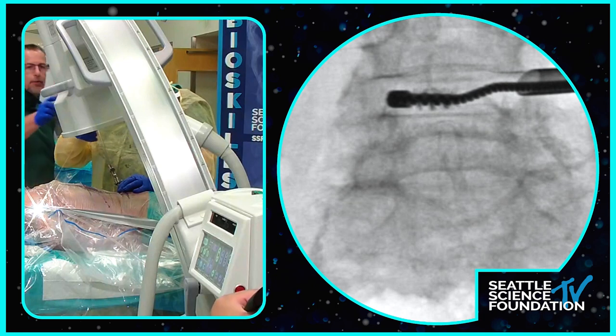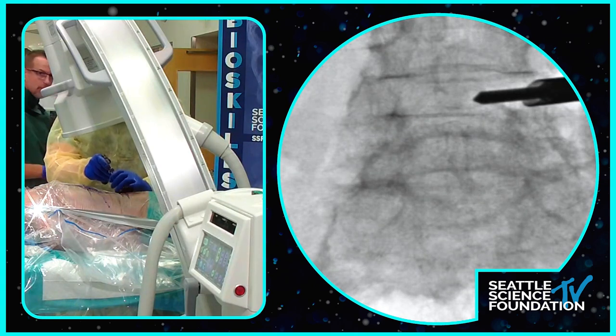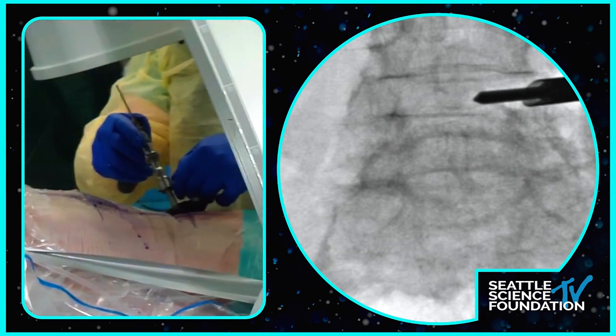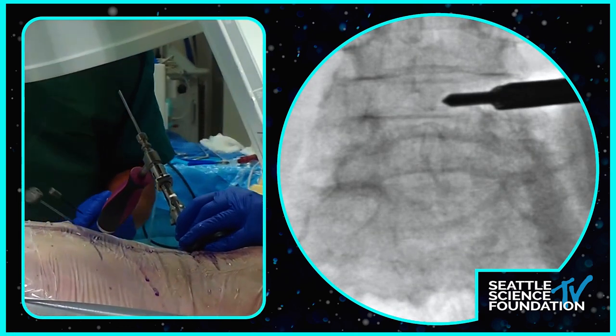I think it'll be fine. Pressure on there. Yep. So now the implant goes in, picture there. And I got to advance this a little bit. So, Ray, you want to tell us a little bit about this implant and what you think? Ray, can you hear me? How do I get this to advance a little bit?